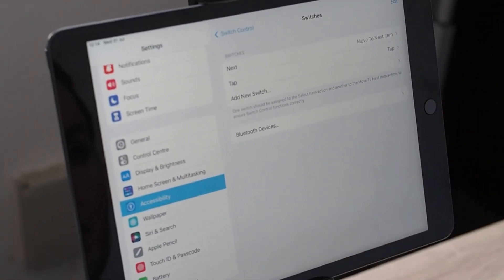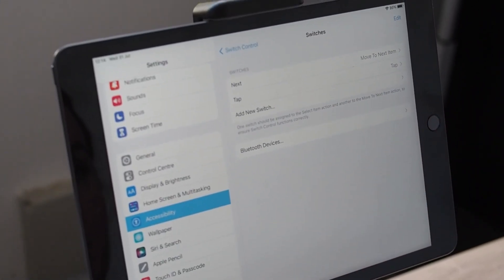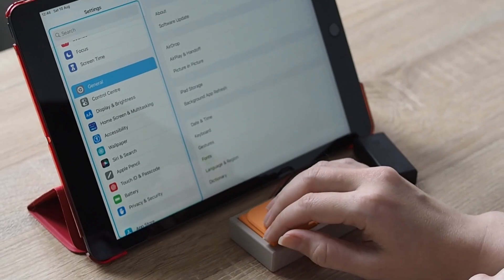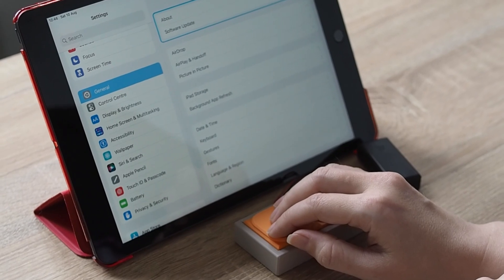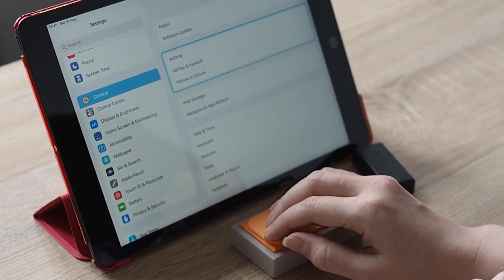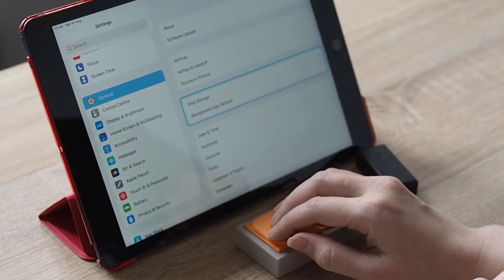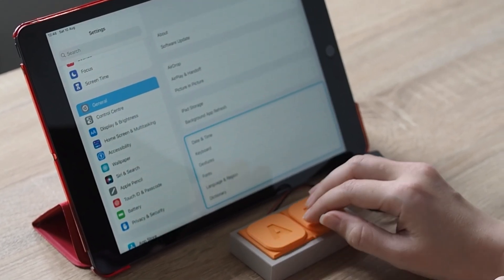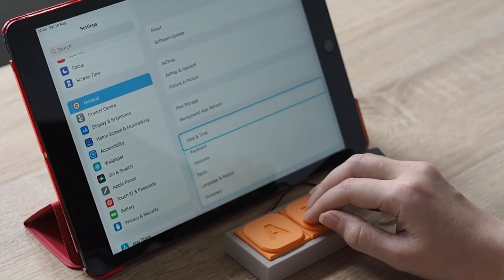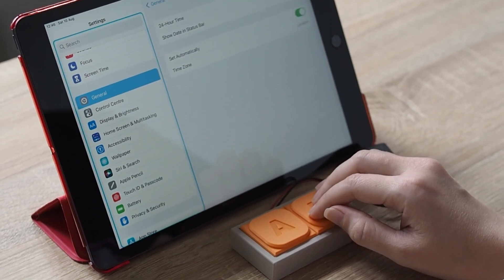When switch control is activated, a blue border highlights an item or a group of items. Pressing the A button will change what item is selected, and once the desired item is reached, the B button can be pressed to select it.